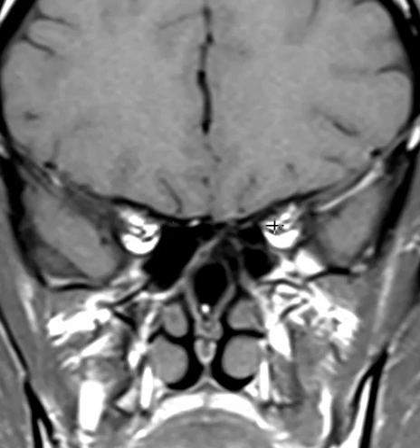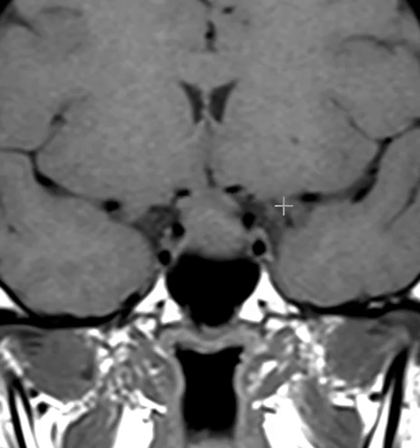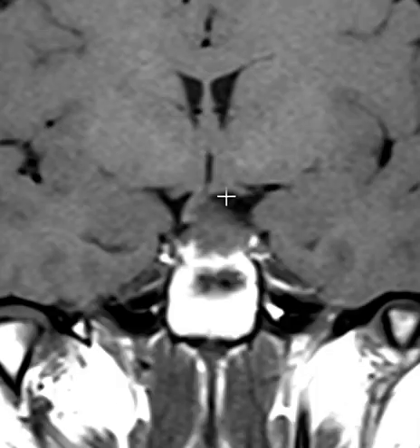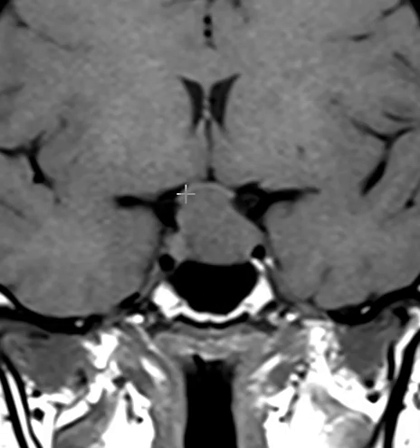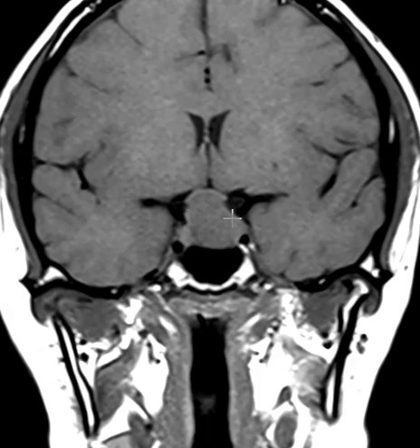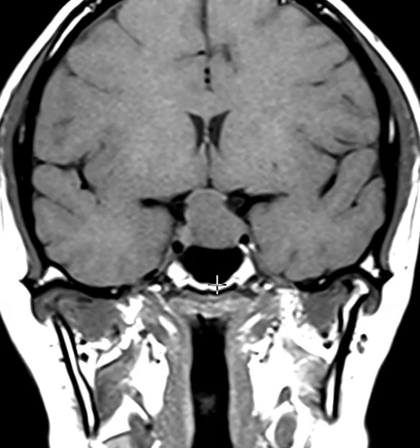There's a gray line here — this is the optic chiasm. The nerves from the eyes come together: here's one, here's the other. We watch them come together and bridge right here combined, then they separate back out. When they come together we call this the optic chiasm, and the pituitary gland is right beneath that. When the pituitary tumor grows large it can grow up into the suprasellar cistern, and if it grows big enough it'll push on the optic chiasm just like this — we see the optic chiasm is elevated and compressed.